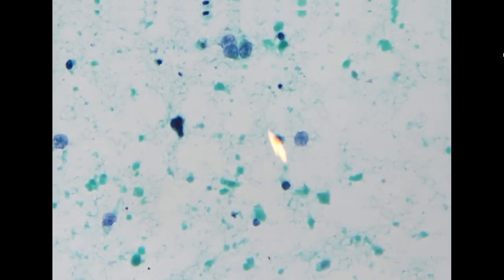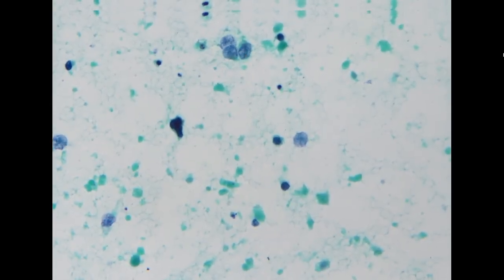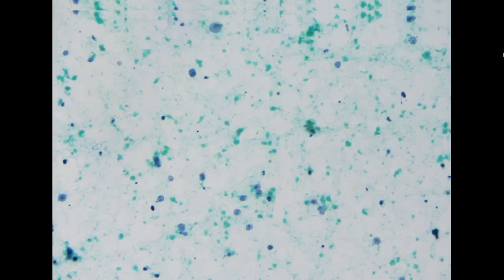However, we still can appreciate some atypical cells, mostly with naked nucleus without cytoplasm. Some of the cells are in clusters. For primary lung cancer, usually you won't see this prominent necrosis pattern.